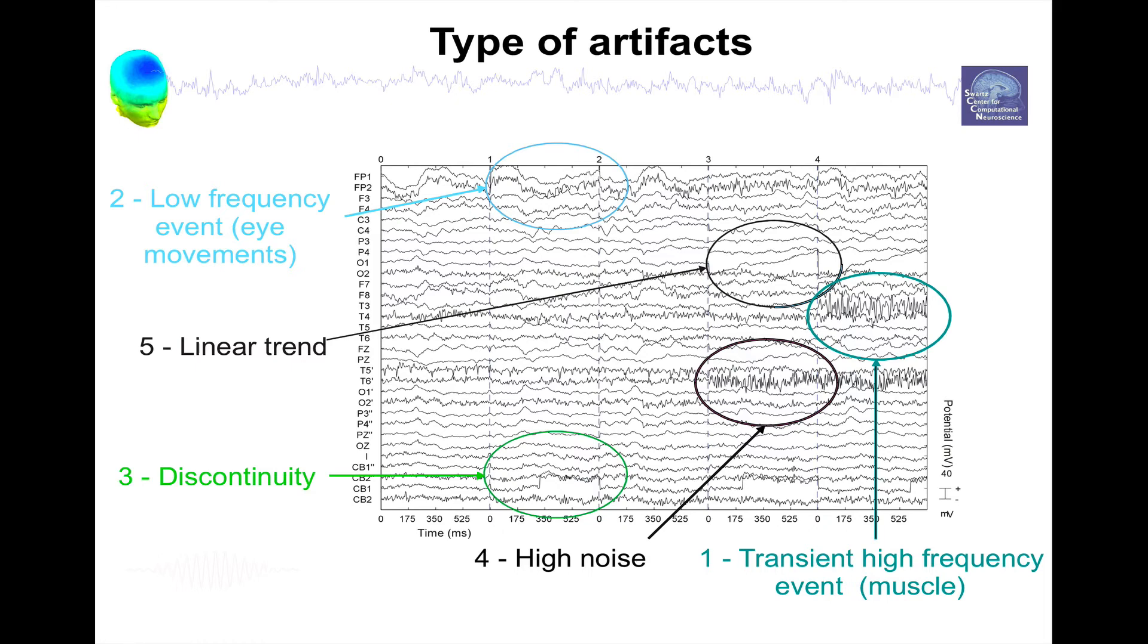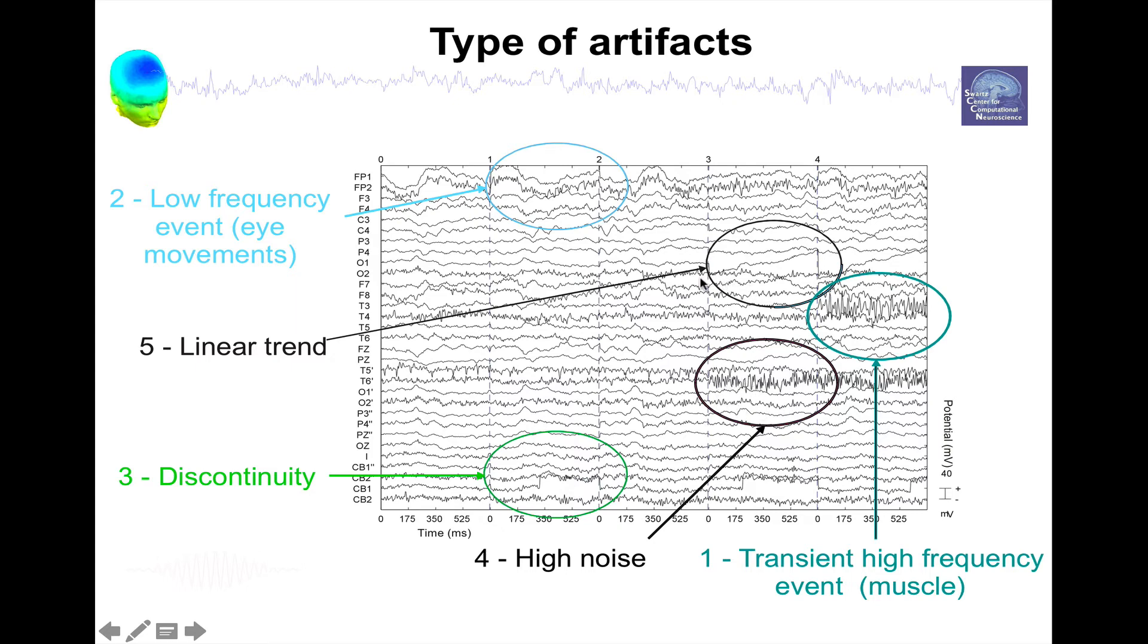You can have also discontinuity in the signal as we can see here, when one electrode jumps, it's just an artifact of the amplifier. You can have high noise that's not muscle, it's just electrical noise, and you can also have linear drift in your data.